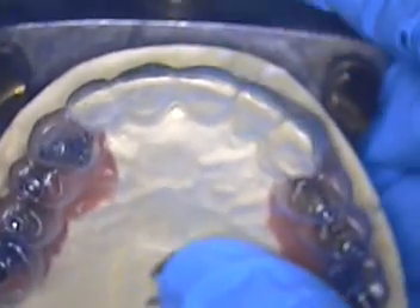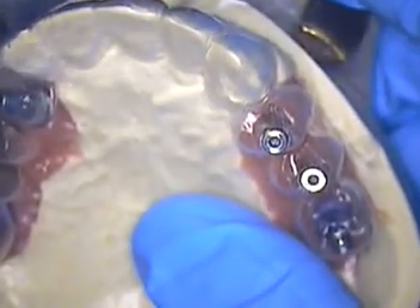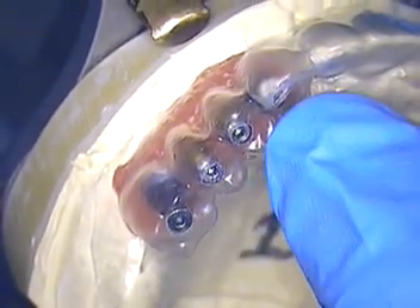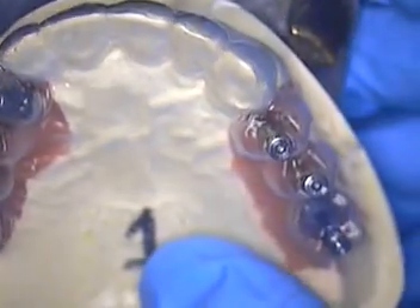I just wanted to get this case out to you in steps so that you can see how it develops and whether we can succeed with going with screw-retained versus custom abutment and cement-retained.